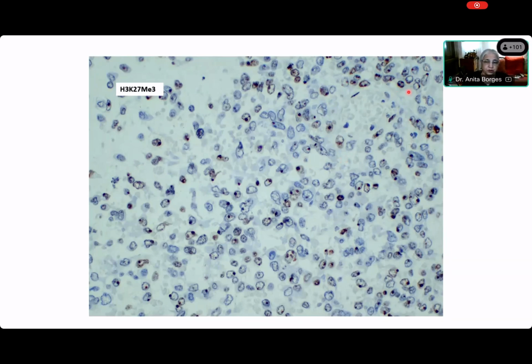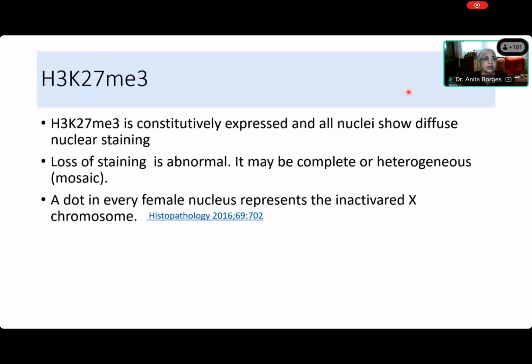Okay, the diagnosis was a malignant peripheral nerve sheath tumor, and it tells us something: that the malignant peripheral nerve sheath tumor can express TLE, can express CD56, it can express BCL2, it can express the synovial sarcoma markers. It will not express SS18. That it will not express. Okay, but not everybody has SS18, so it's something that you have to be aware of, that you don't make a diagnosis just on immunohistochemistry. All right, sorry. So this is about H3K. You don't need to know about this.